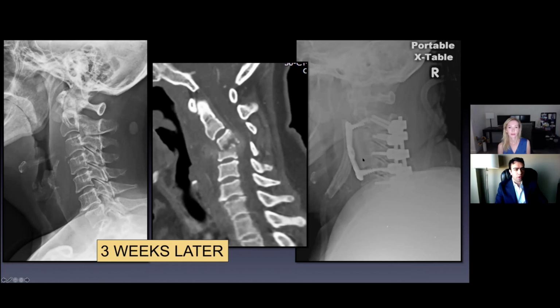It's difficult for bacteria to form a biofilm on titanium. There are properties of that metal that are somewhat bactericidal. And with the more recent technological advances, you can get expandable titanium cages that you can use to place in this setting, which is what I would have used. I would not have used allograft in this setting.